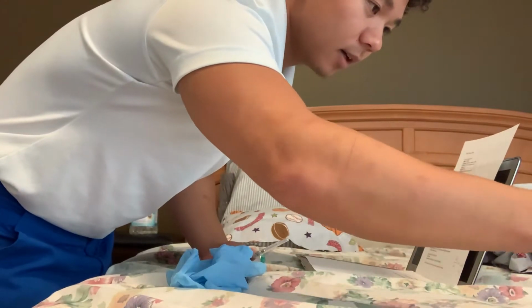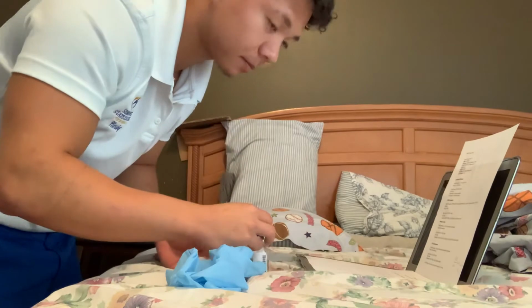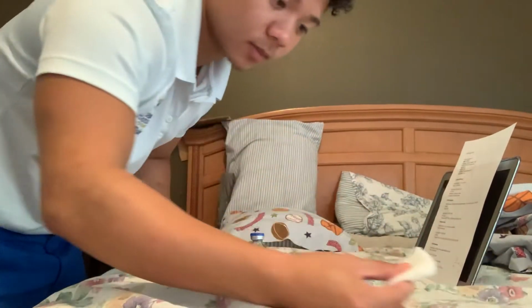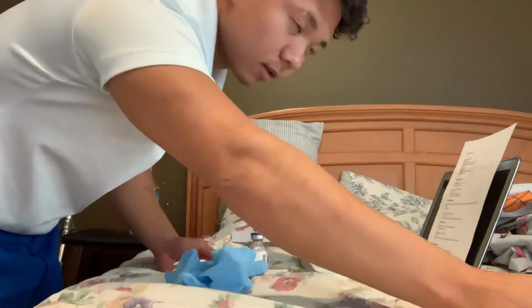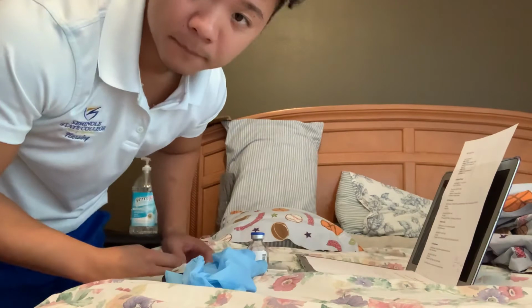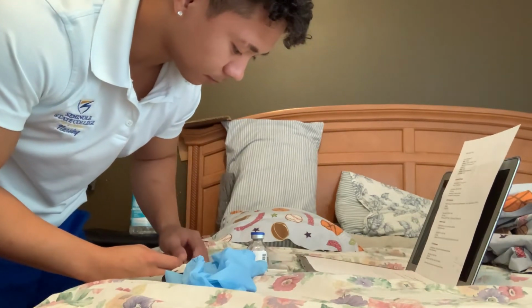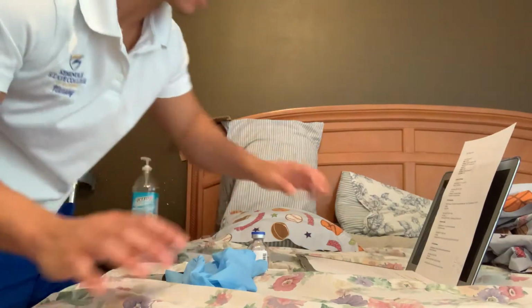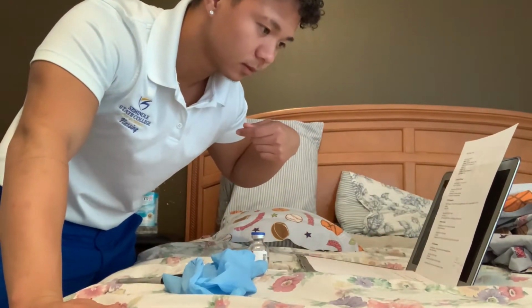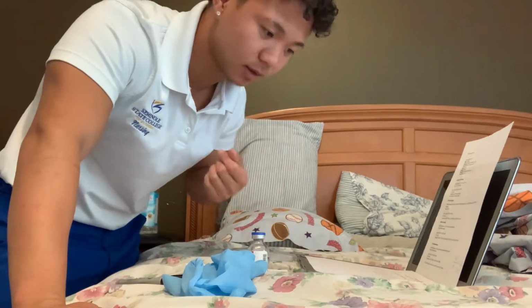I have my influenza vaccine, my vial, alcohol pad, gauze, and a pen. I'm going to start by taking everything, and I would also need my EMR and my sharps bin.